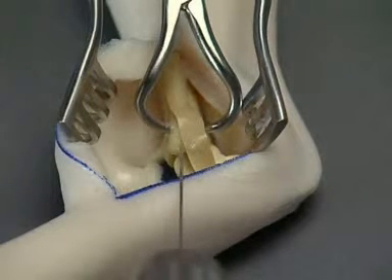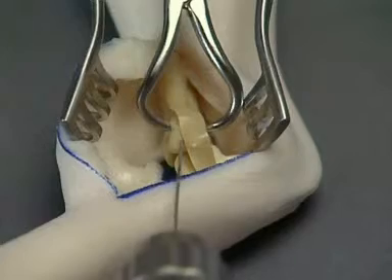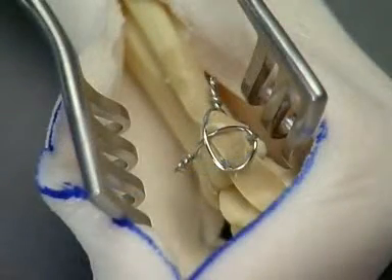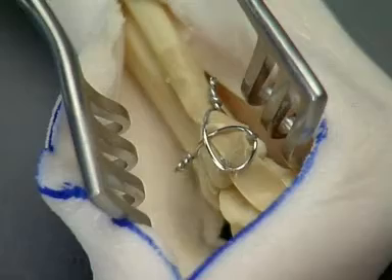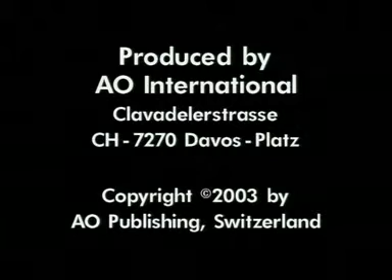Two 1 mm K-wires are inserted from the lateral malleolus into the tibia. The tension band is completed with a cerclage wire formed as a figure of 8. The protruding K-wires are cut and bent.